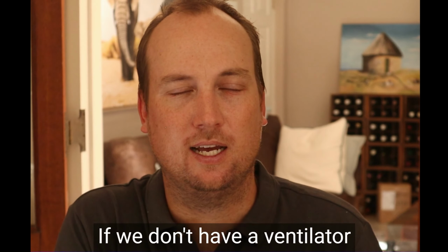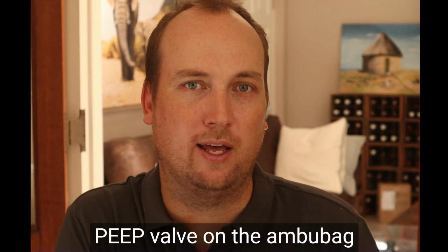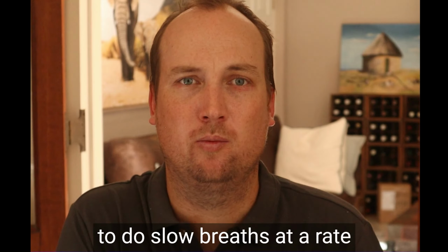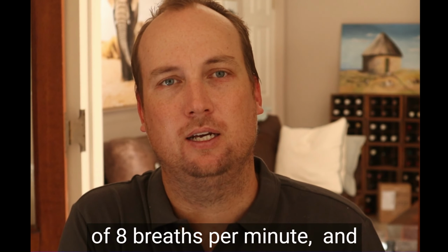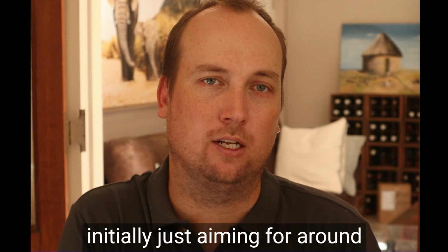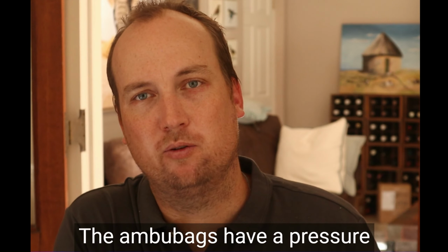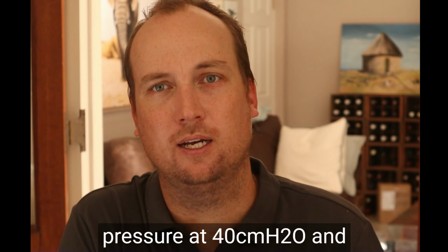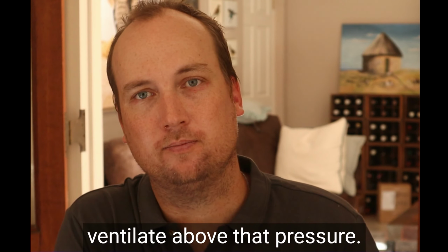If we don't have a ventilator and we're using an ambubag, we want to make sure that the PEEP valve on the ambubag is set at 0, and we want to do slow breaths at a rate of 8 breaths per minute, and initially just aiming for around 200 ml tidal volume at a time. The ambubags have a pressure release valve that releases pressure at 40 centimeters of water, and so it won't allow you to ventilate above that pressure.